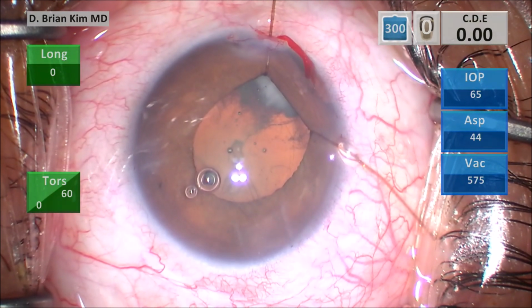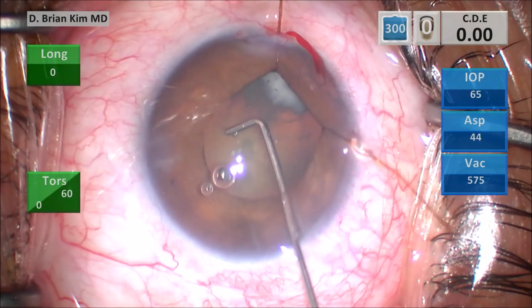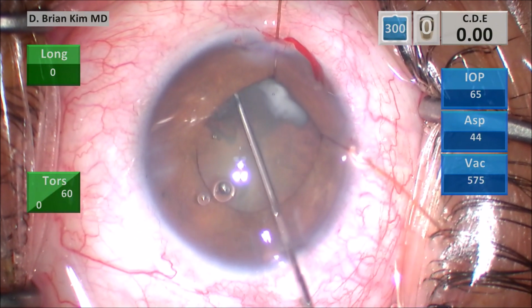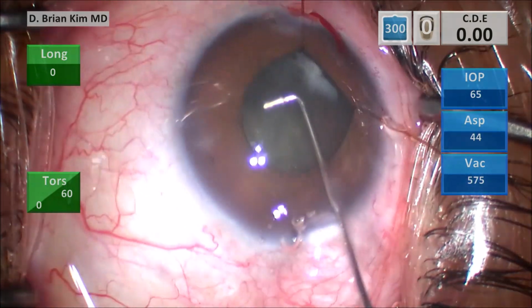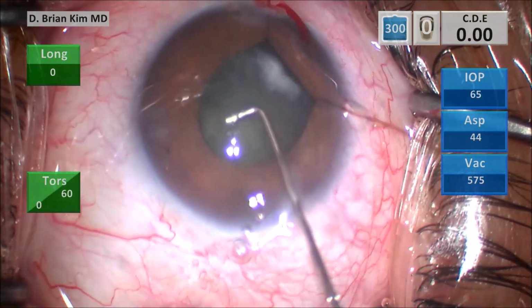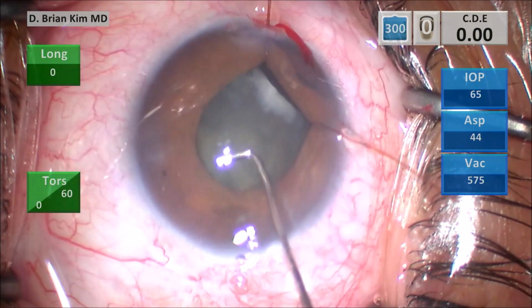And this is the right-angled hydrodissection cannula. I slide it under the rhexis edge contra-incisionally, being very gentle, wiggling it a little bit, making sure I'm in the bag, getting my hydrodissection wave, decompressing the bag. I'm always mindful in these situations when you have a little bit of a capsular block and that fluid is trapped in the bag, you don't want to push too aggressively down on the lens because of the potential zonular dehiscence.